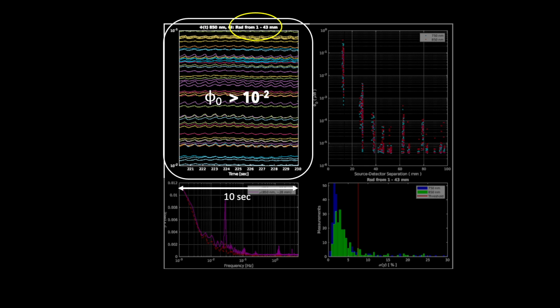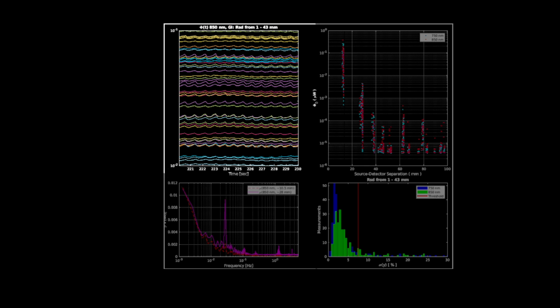The expanded view permits closer scrutiny of the data, which should be examined for artifacts that may have been obscured when previously plotting data from the entire array. Often, small amplitude deflections are apparent in the expanded plot that repeat at approximately 1-second intervals. This signal is known to reflect the cardiac pulse and motivates the first of 3 metrics extracted from the data.